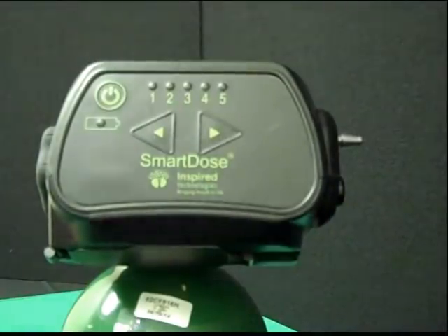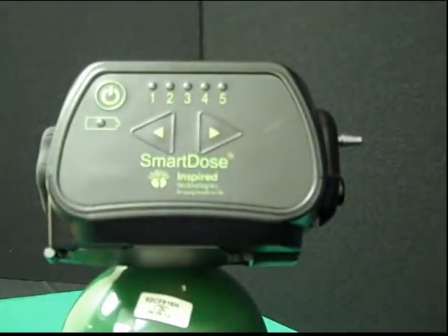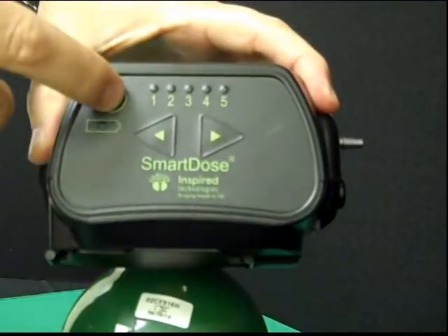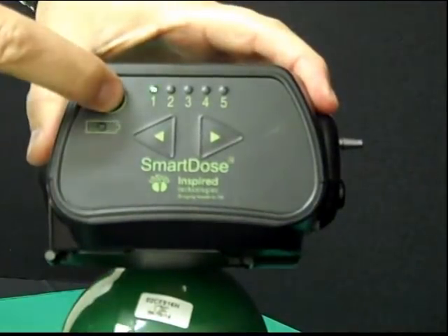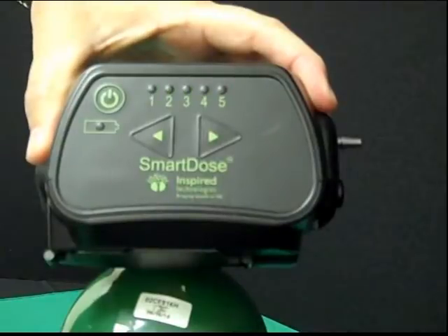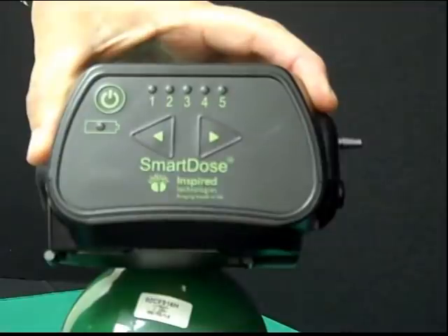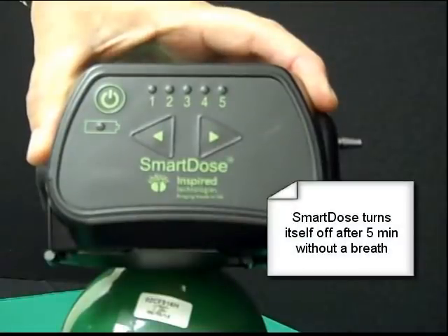The control label on the unit is very easy and intuitive. To turn the unit on, simply press the on/off button. You will see the lights roll up on the label to indicate that the unit is turned on, and a light will flash to show you where the unit is currently set. To turn the unit off, simply press the button again and the lights will scroll down. Alternatively, simply stop breathing on the unit for five minutes and SmartDose will turn itself off.